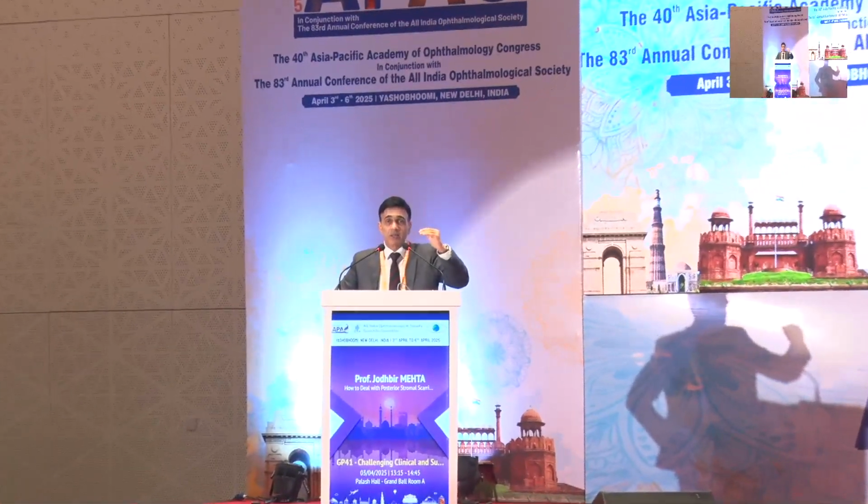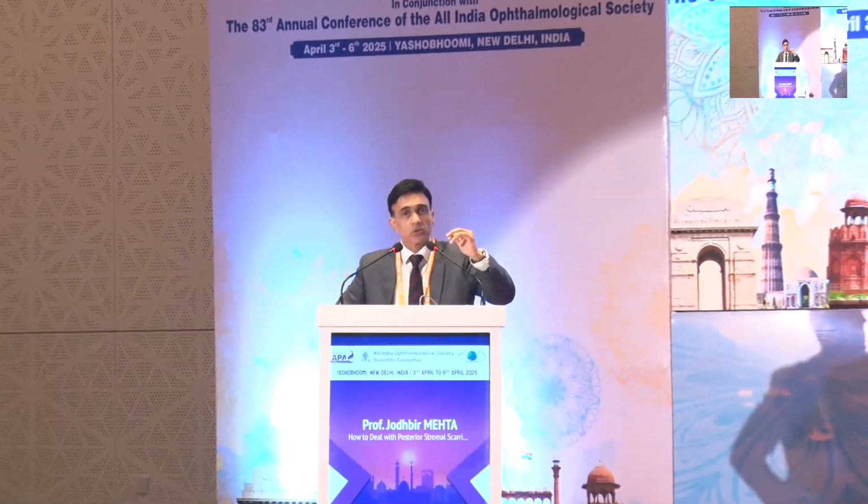That is very beautiful surgery. I would like to ask, when you see the fold in the endothelium, at what point do you consider this a fixed fold that you have to remove before the DMEK surgery? I think if you do the OCT and look at it, typically look to see whether there's a change in the OCT signal. If it becomes slightly whiter, it's going to tell you it's a chronic fold, because it's telling you of chronicity, and fixed folds in the matrix will definitely be chronic.